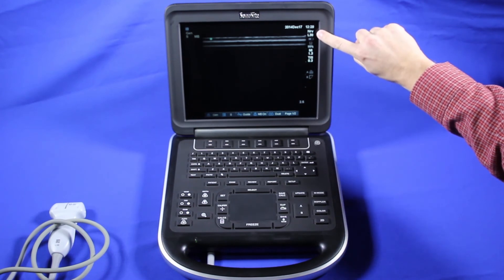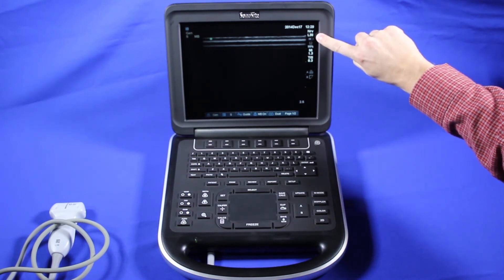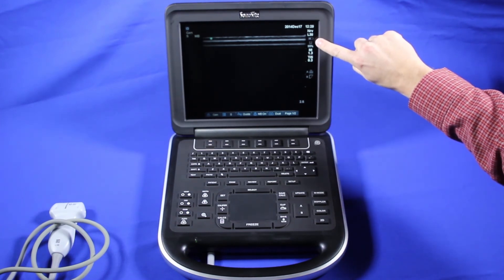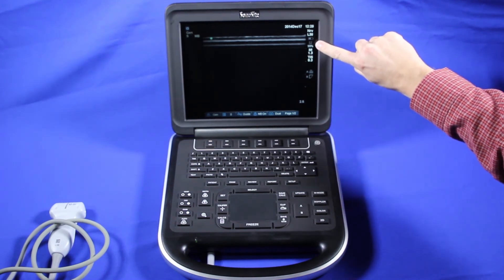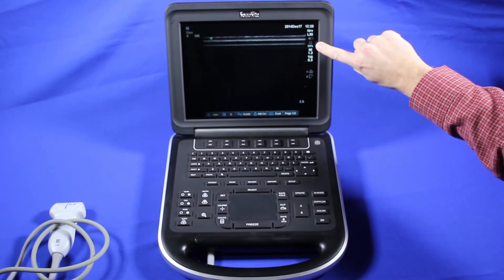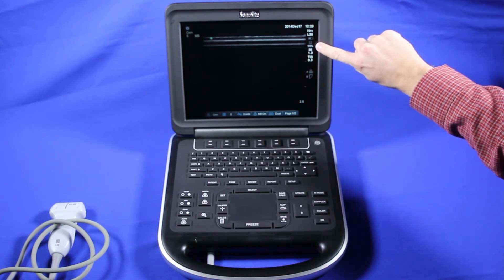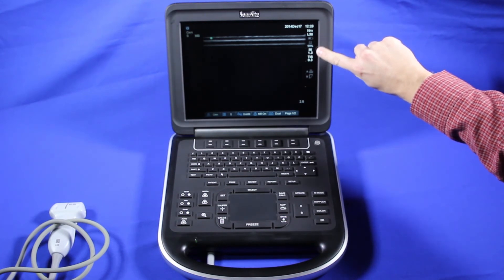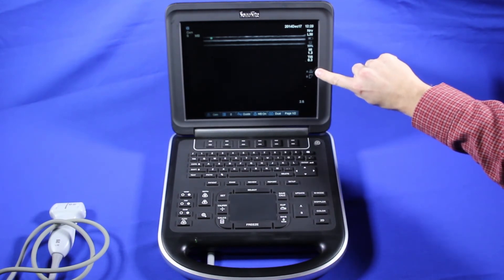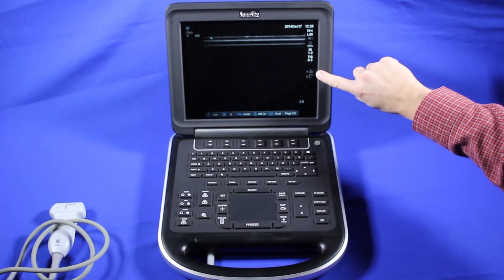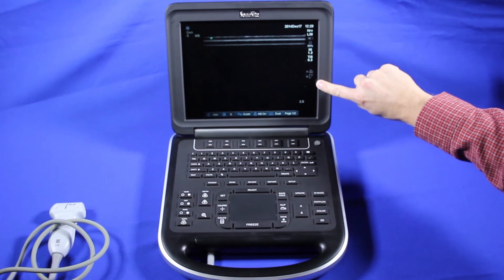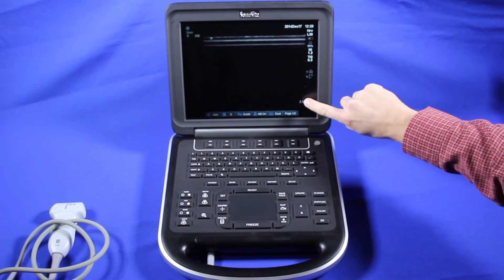The time, the exam mode, the imaging preset, the probe, your battery level, how much storage is remaining to save on your disk, your indices, your printer that's attached, and the USBs that will show up down here.